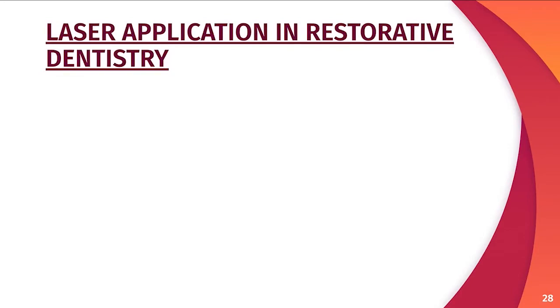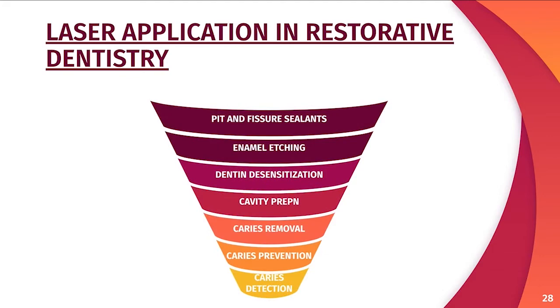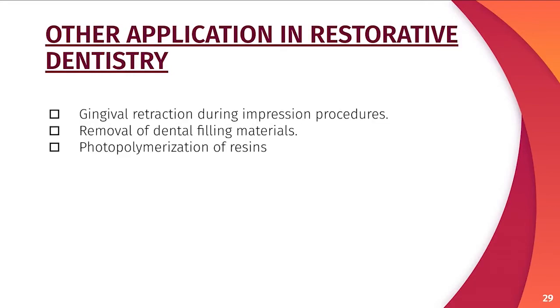Now we'll discuss the laser applications in restorative dentistry and endodontics. Laser applications in restorative dentistry include caries detection, caries prevention, caries removal, cavity preparation, dentin desensitization, enamel etching, pit and fissure sealants. Other applications in restorative dentistry include gingival retraction during impression procedures, removal of dental filling materials, photopolymerization of resins.